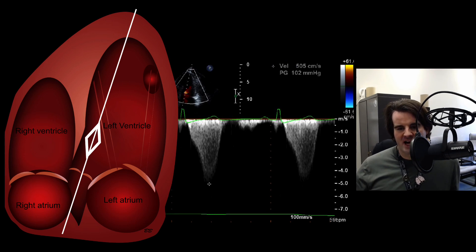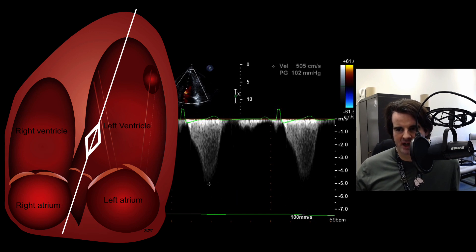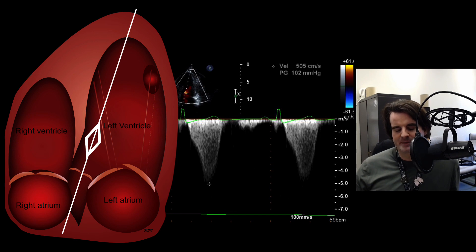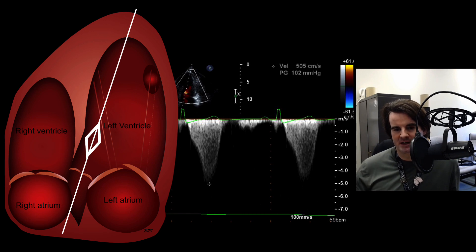We use continuous wave Doppler to measure the maximum velocity once we understand the obstruction and its location — whether it's SAM or within the cavity itself. We quantify the degree of obstruction using the modified Bernoulli equation: four times velocity squared. In this case, a velocity of roughly 5.05 meters per second produces a peak gradient of 102 mmHg. But since CW is range ambiguous, we must be certain we're capturing the accurate site of obstruction. If there's a mid-cavitary gradient but also aortic stenosis, you'll mix signals, so meticulous identification of the obstruction is required.